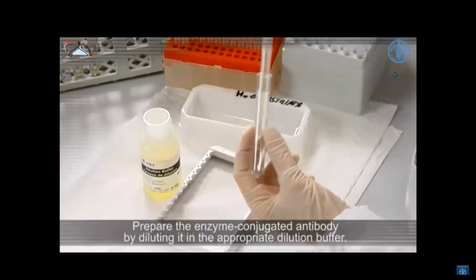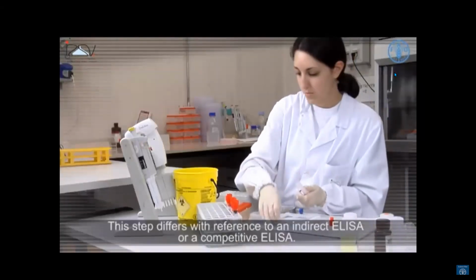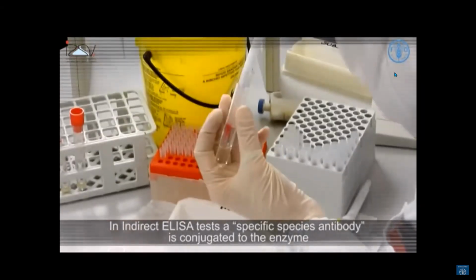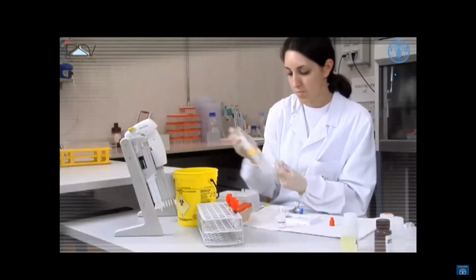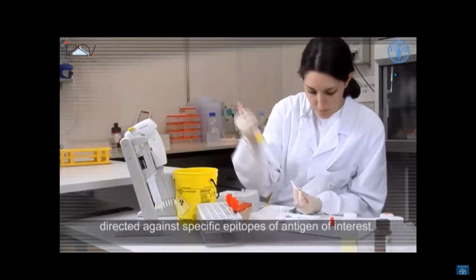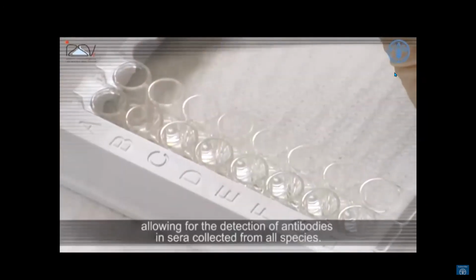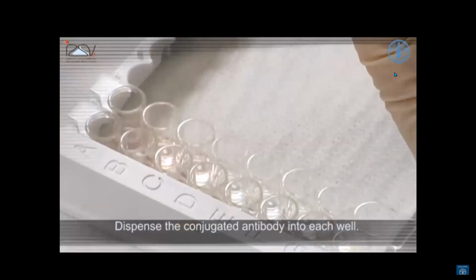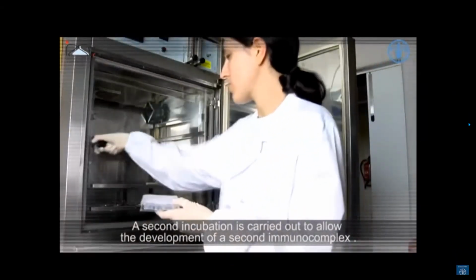Prepare the enzyme conjugated antibody by diluting it in the appropriate dilution buffer. This step differs with reference to an indirect ELISA or a competitive ELISA. In indirect ELISA tests, a specific species antibody is conjugated to the enzyme, and the test can be used only for the species indicated by the manufacturer. In contrast, competitive ELISA is based on a monoclonal antibody enzyme conjugate directed against specific epitopes of the antigen of interest, allowing for the detection of antibodies in sera collected from all species. Dispense the conjugated antibody into each well. A second incubation is carried out to allow the development of a second immunocomplex.